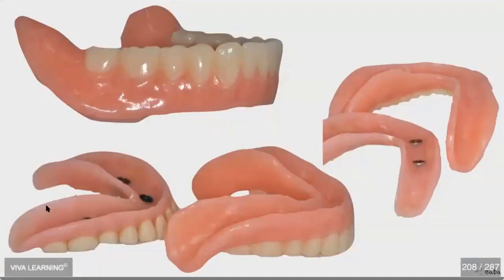You notice here the difference in the retromylohyoid fossa area. This is how short it is, and look how long it is. The buccal shelf, and you notice the retromolar pad now is covered.